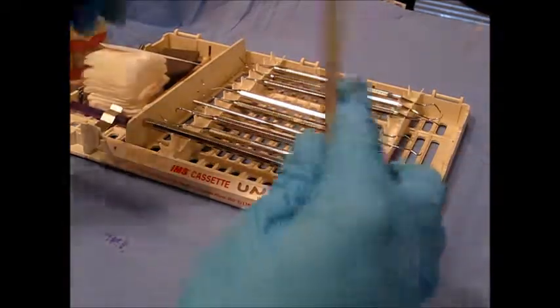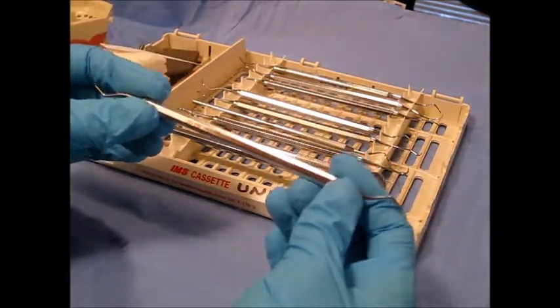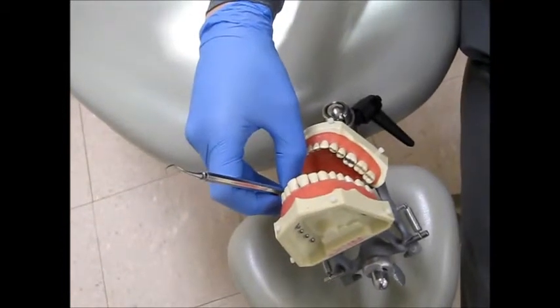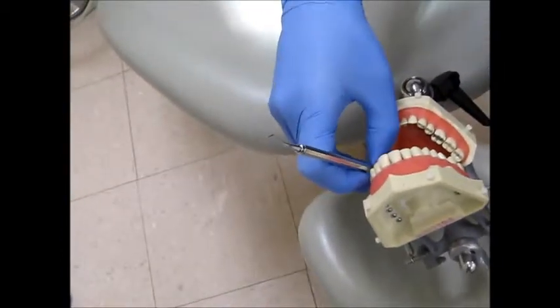Now let's see this instrument clinically — the SG78. Because of its simple shank, it does not go interproximally, but it is used posterior line angle to line angle, from the distal line angle to the mesial line angle.